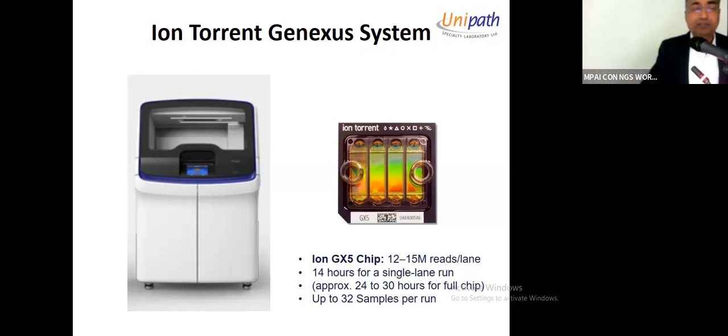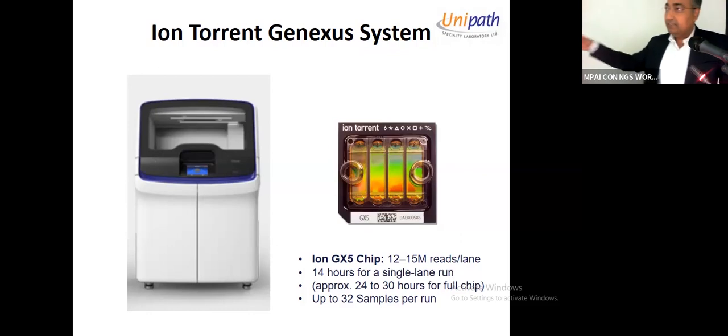The only drawback is that once you have run this system, the chip has to be used within 15 days. If it is not used, if you are not able to utilize one lane in different ways, then this goes to waste. That is a big drawback in using some of the equipment, but we are able to use it.